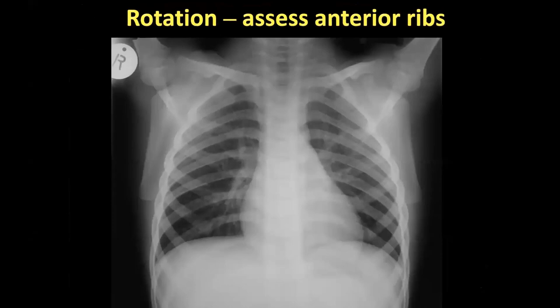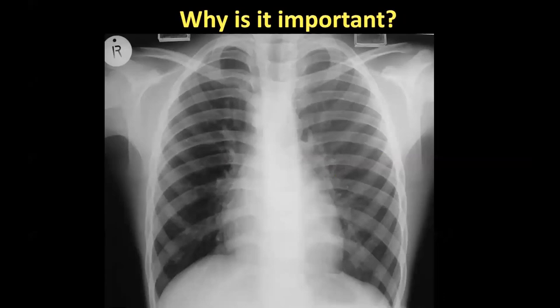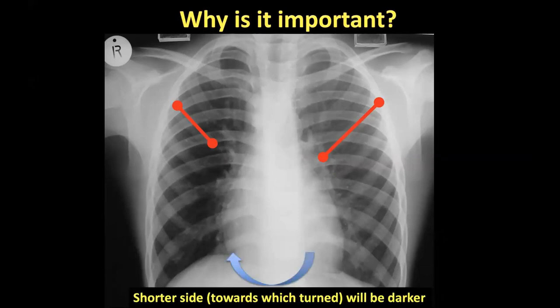The second thing to assess is rotation. Looking at the anterior ribs, both sides should be of similar length. This patient is rotated towards the right — towards the side of which the rib is shorter. This is significant because the shorter side, towards which the patient is turned, will be darker or more lucent. If you aren't aware of this, you might go 'I've got a hyperlucent right lung — do I have nodes, a foreign body, or bronchiolitis obliterans?' You need to assess technique before you can assess the X-ray.